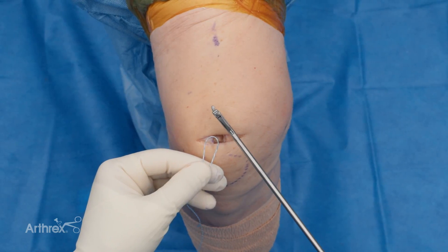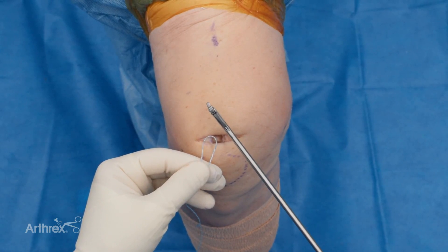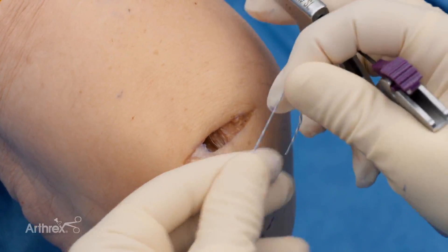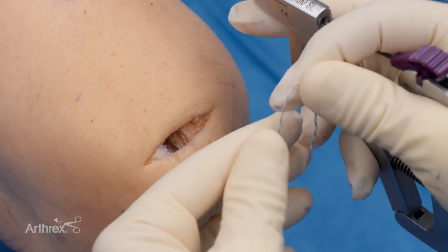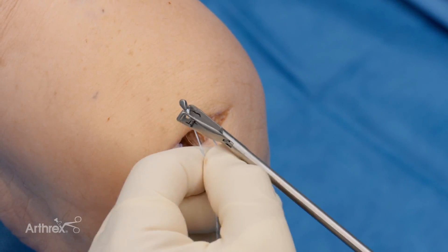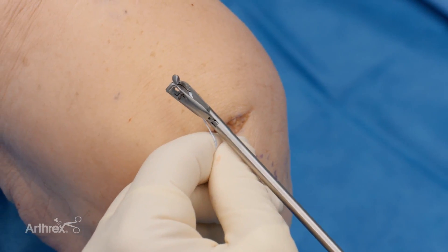I think most everybody's familiar with the scorpion. In this case, I'm using the FastPass Scorpion, and this is our fiber link. You'll take the free end of the suture, you'll double it over, and just load it into the slot in the actual device, and pull it all the way to the base of the slot.